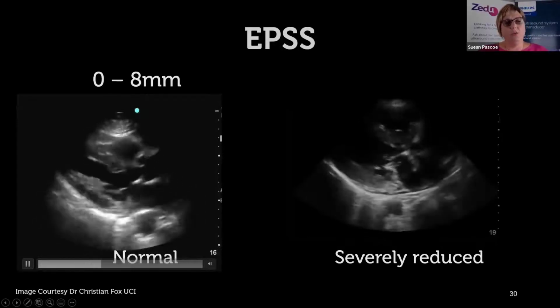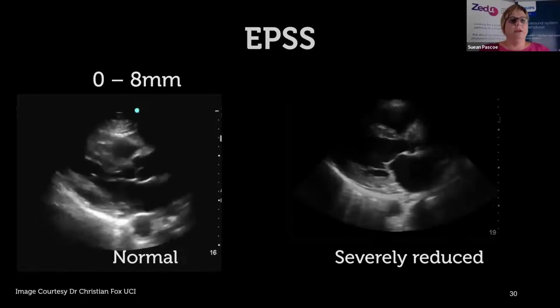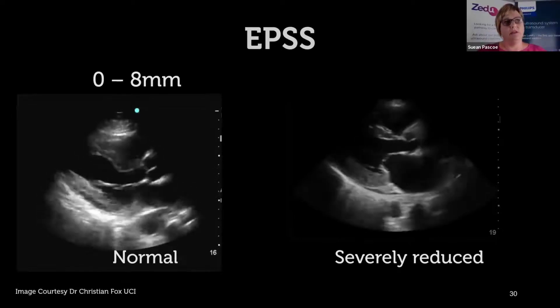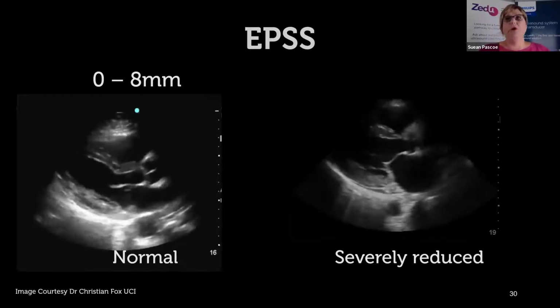And so in a normal heart, it should increase by about 30% in thickness. So you can then put your hand over and just look at the wall and see, as it squeezes, does that ventricular wall get thicker? Again, this is all B-mode measurements.